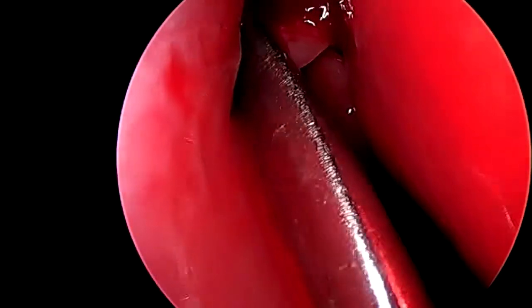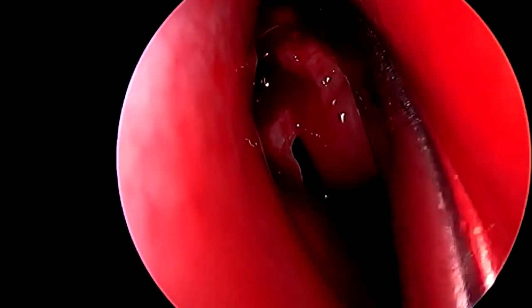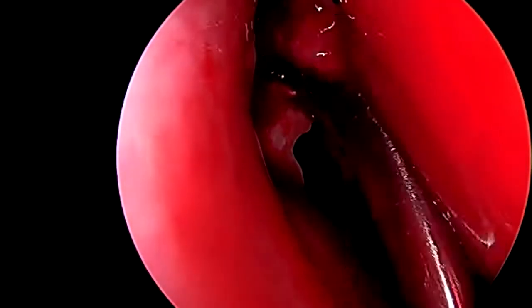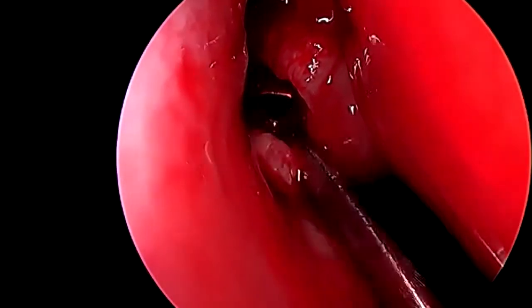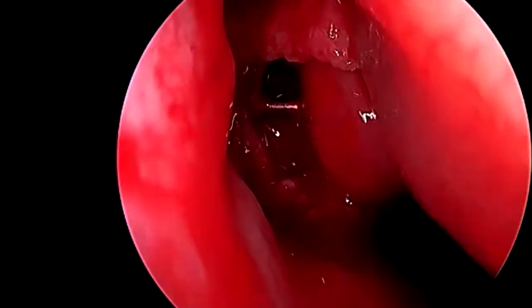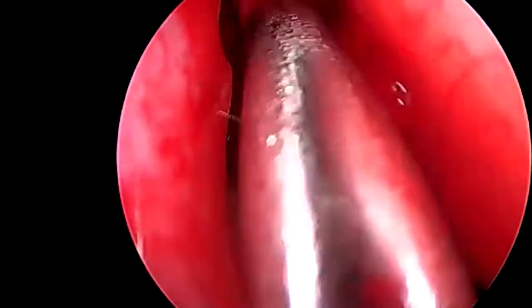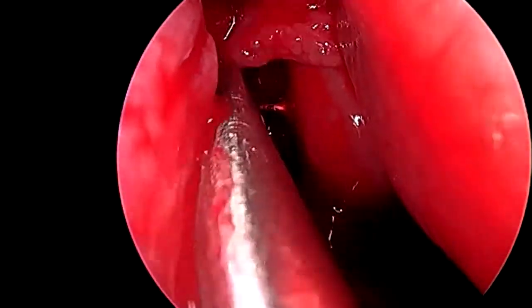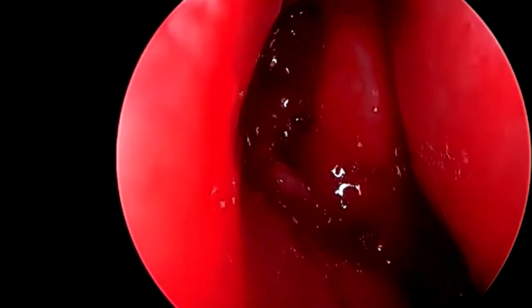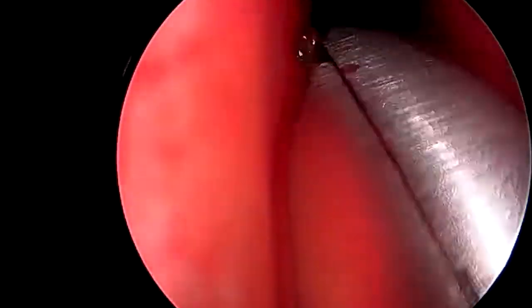A freer elevator is used to elevate a mucosal flap in the region of the previous osteotomy in order to identify if there is recurrent neobone formation in the area and where the problematic scar is, and to reopen the osteotomy site.